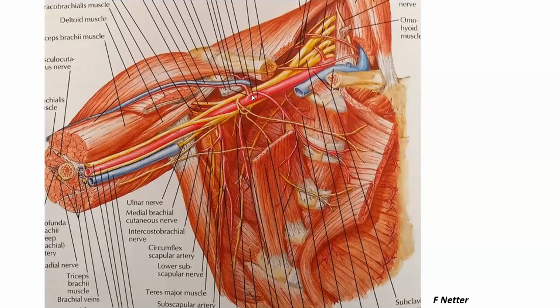So you can tell the ideal location for accessing the axillary artery is that mid segment. You don't want to go distally because of the brachial plexus. You don't want to go proximally because you're getting close to the subclavian artery and to the inside of the chest and to the origins of the brachial plexus.